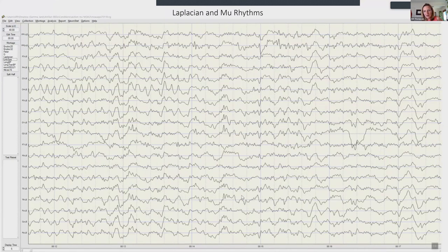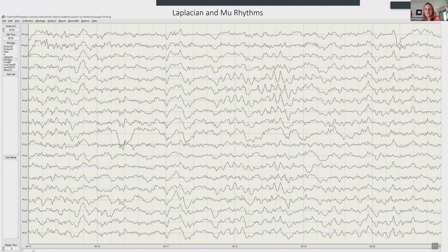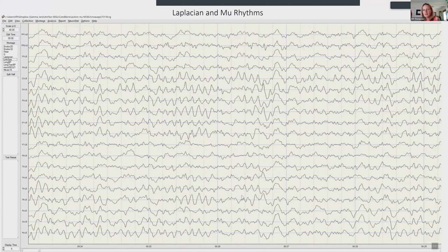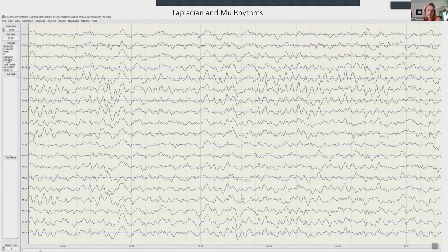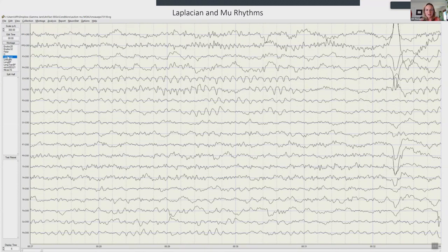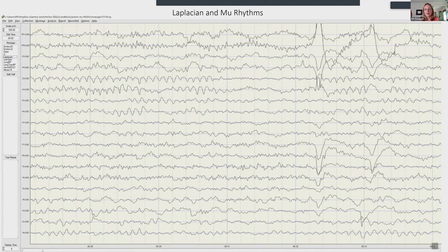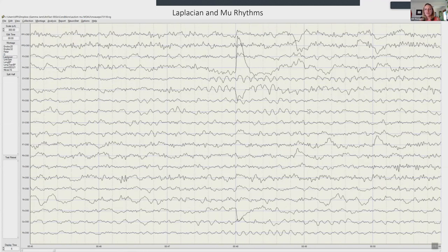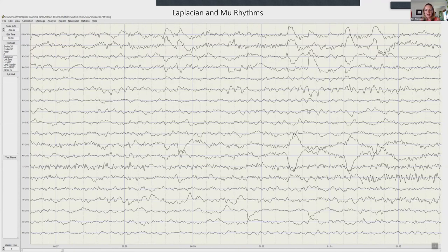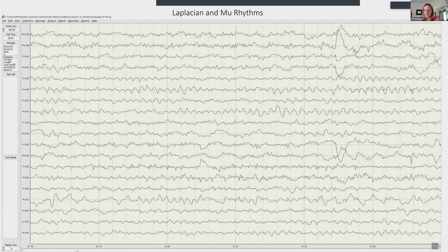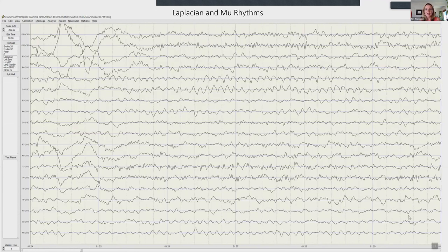Laplacian is great for the mu rhythm and for the lambda rhythm. The mu rhythm — a monomorphic waveform — lives at C3/C4, though it can be expressed posteriorly at P3/P4 or anteriorly at F3/F4. Going to Laplacian really draws out that morphology — that one monophasic waveform repeating at C3/C4 — making it much clearer. This represents frontal lobe disengagement, mirror neurons not communicating — someone somewhat checked out, possibly ADHD or autistic.